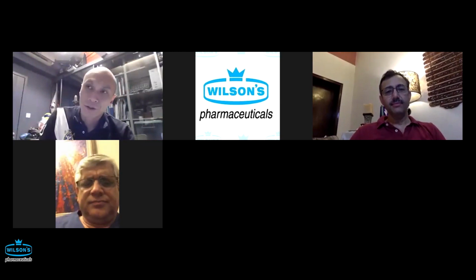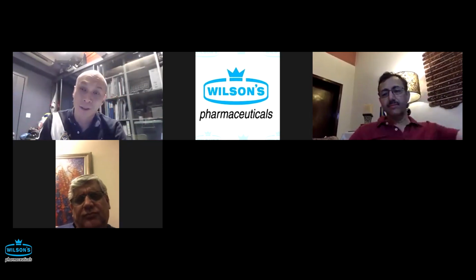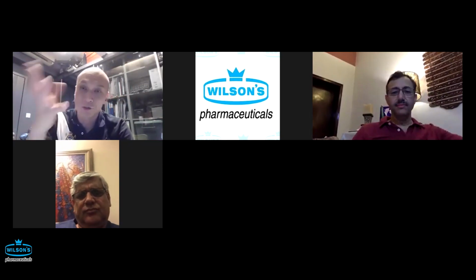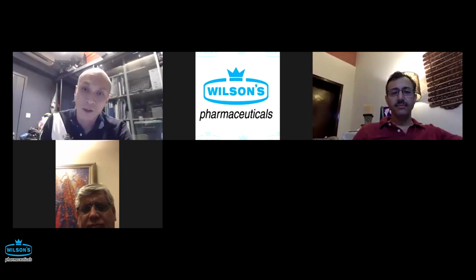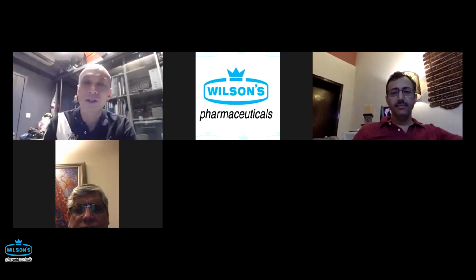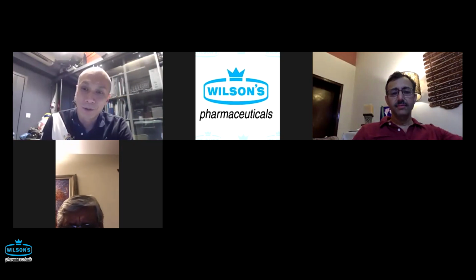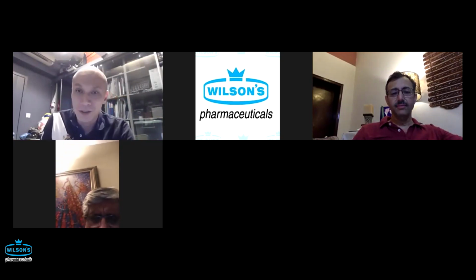The ease of fracturing of the stone, of course, depends on the energy source. If you're using an EHL, it tends to cause a better fragmentation. If you are using a laser, it tends to be very focused on the fracturing. But either method usually takes time, so better to perform it under MAC or general anesthesia.